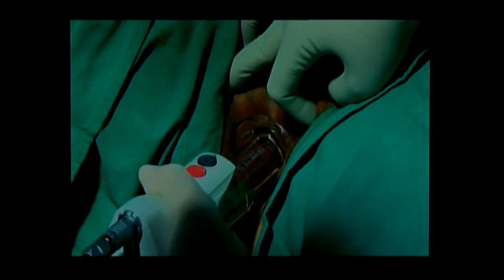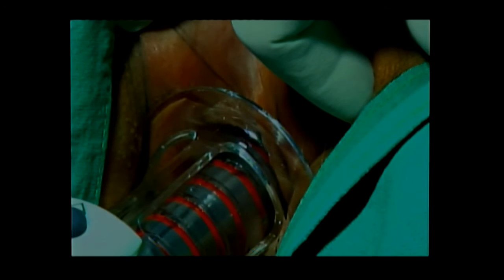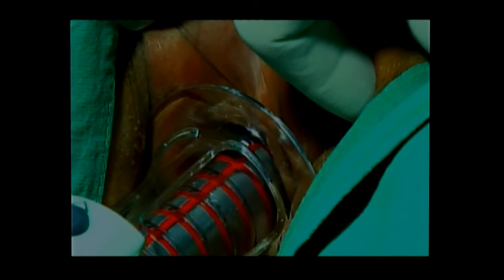People are asking, did you use any lubrication? It depends. If it's very atrophic and very dry, or a very narrow vagina, I use baby oil. Don't use water because it will interfere with the laser beam.